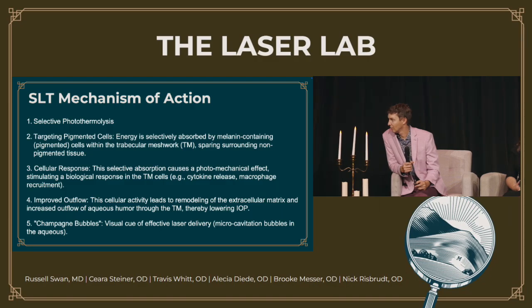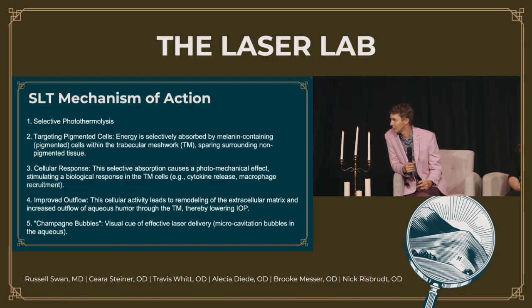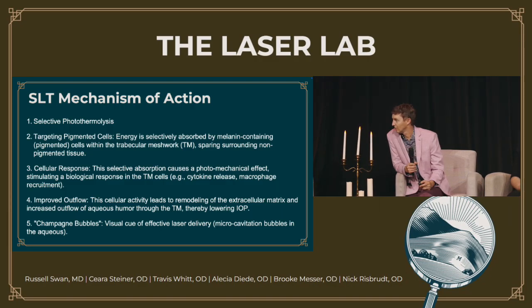With repeatability too, if they respond well the first time, the chances that they're going to respond well the second time is super high. And we talked about how MIGS was a bridge between drops and tubes, and now with SLT I think of SLT as a bridge to MIGS.